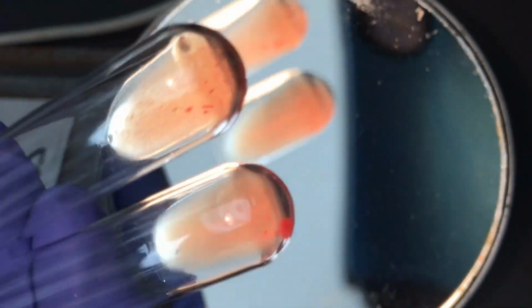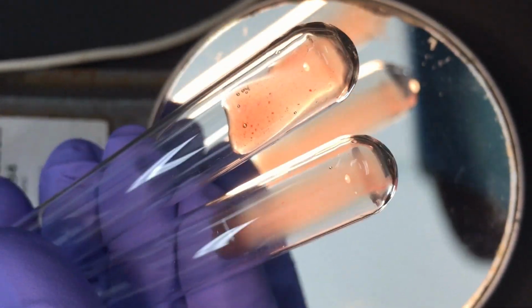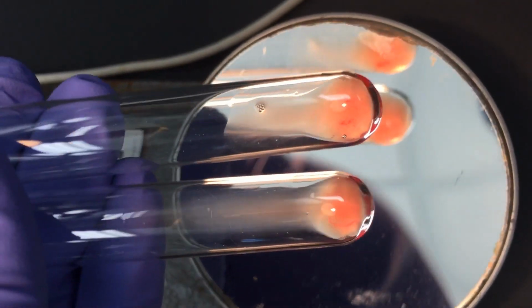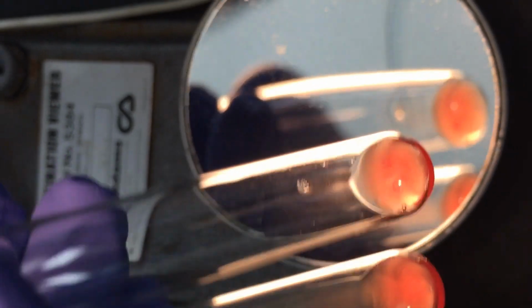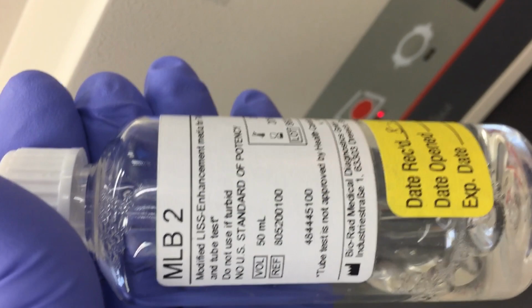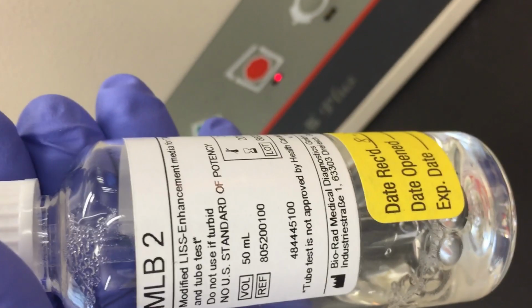And once again, tube 5 is on the left. You can see how you get this kind of swirling pattern. And then tube 6 is on the right, sorry. Okay, now then, those were all room temperature. I'm going to add our enhancement media, the LISS, low ionic strength saline, and then we're going to spin them and read them again.